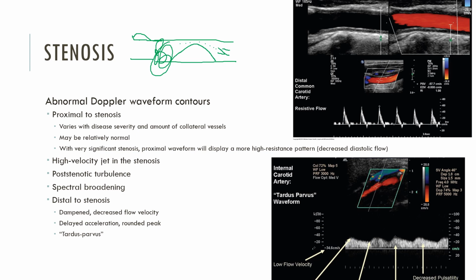We say that the law of continuity will make the blood go so fast through this stenosis that it's going to move the equal amount of flow through this stenosis in one moment than it does in the open lumen down here. Well, at a certain point, that stenosis is so significant, we call it hemodynamically significant. It causes hemodynamic changes, which means no matter how fast it moves that blood, it cannot get as much blood through that region as it could through the lumen over here. Therefore, the blood after it's leaving this turbulence is pushed by a lot less pressure.